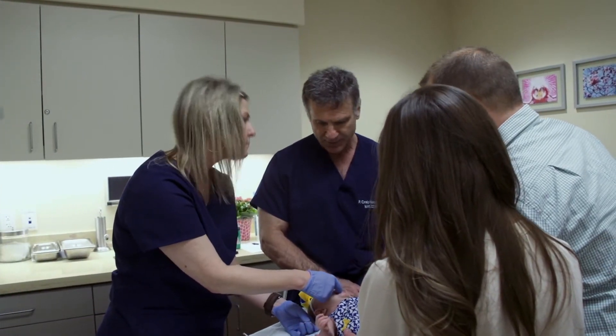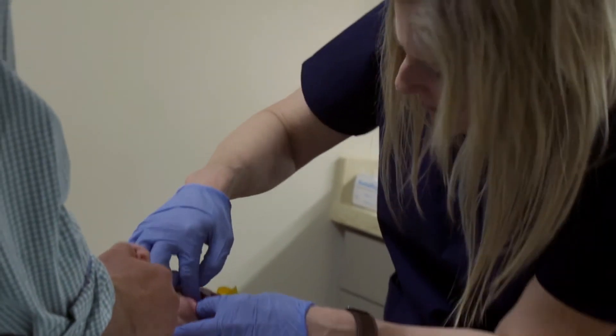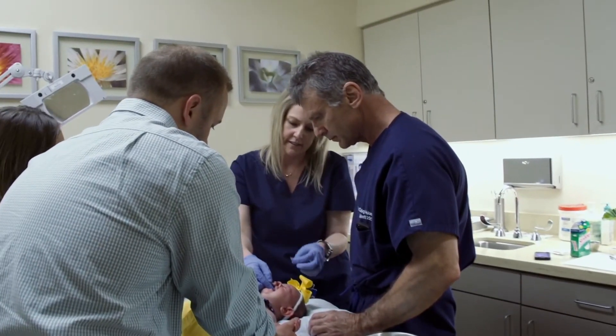My role in treating cleft lip and palate is that I see the babies under Dr. Hobar's direction and I do the adjustments on the NAMM appliance that they wear every day, to start to form the nose and to bring the two segments together when there's a cleft in their palate, and basically get them ready for their first surgery, which happens when they're about 3 months old.